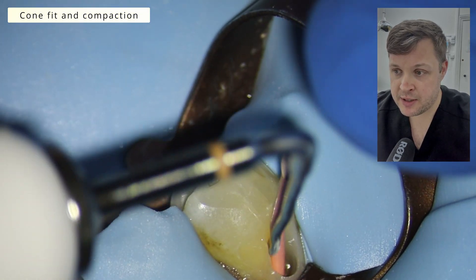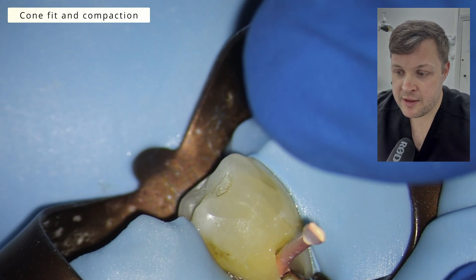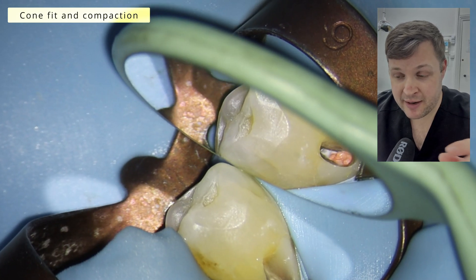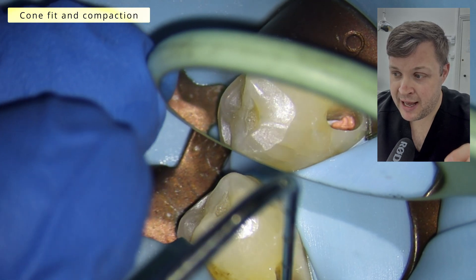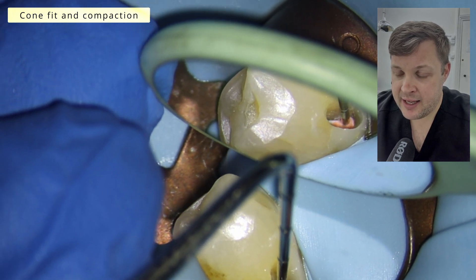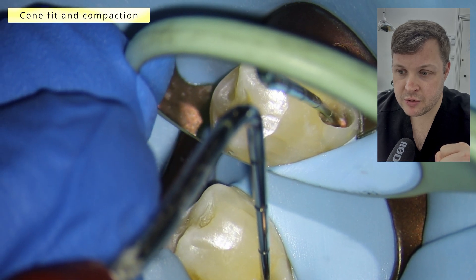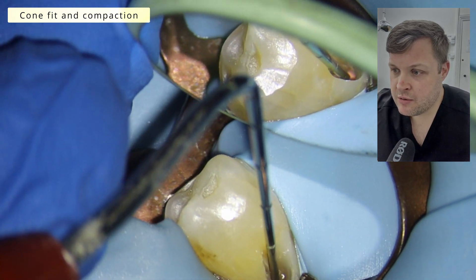I don't want to jam the GP point in — very gently push it to length, then sear it off with the heated plugger. Try not to use the heated plugger too far down the canal with bioceramic, as it makes the bioceramic not work very well. Finally, with the obturation, we're going to compact the cone down with some Mach 2 pluggers. I used to be very ginger with the Mach 2 plugger, but now I really push it in hard to make sure the cone is compacted into the root canal and the sealer gets into all the nooks and crannies.